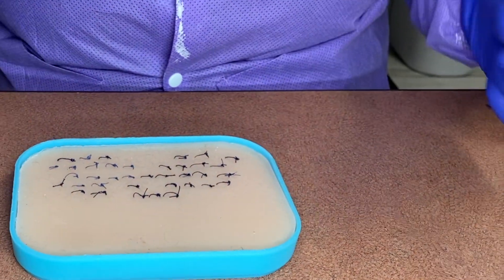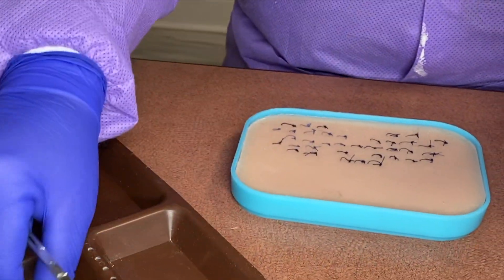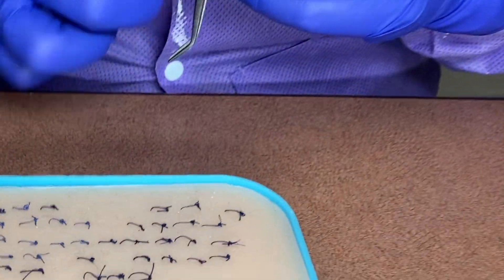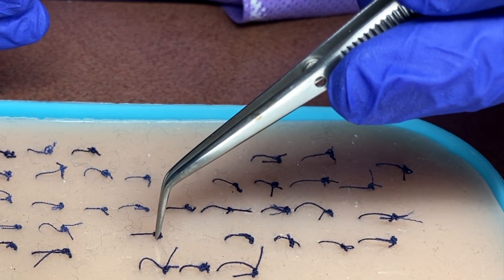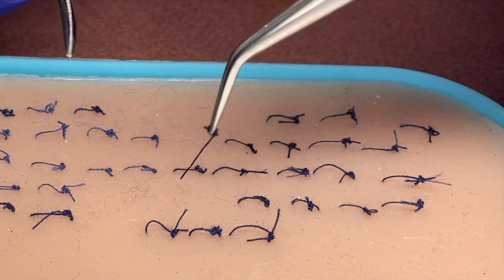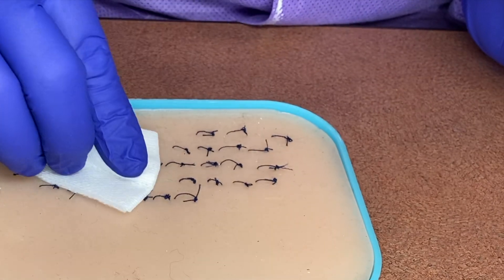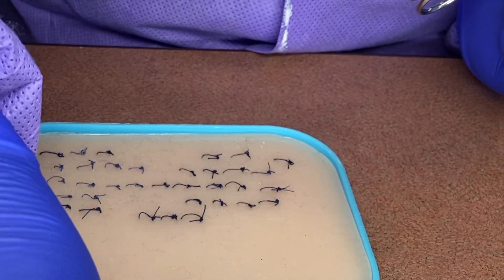Then we'll go to the tissue one. I'm going to grab a two-by-two or a cotton roll — we can use these if the patient has any bleeding. So let's remove one: grab the knot, hold it gently, cut right beside the knot, and pull. If we had a little bit of blood, we could just take our cotton roll or two-by-two, dab it out, and apply a little bit of pressure to wipe off the bleeding.